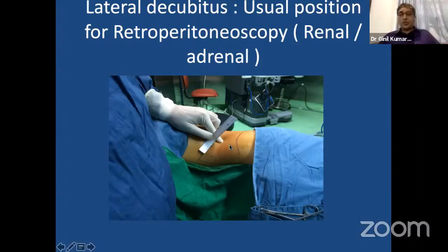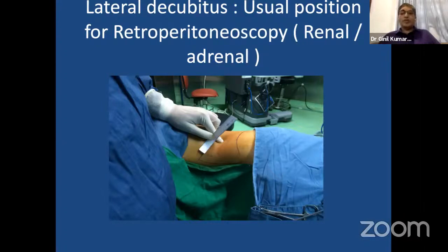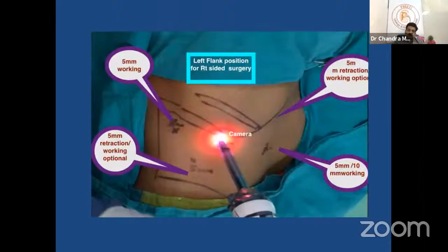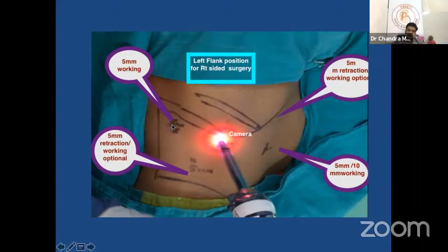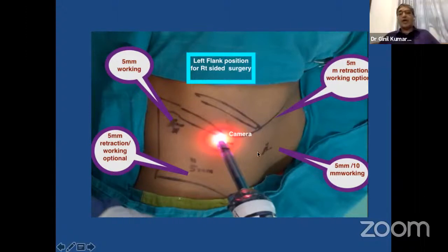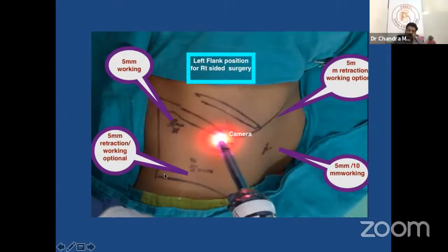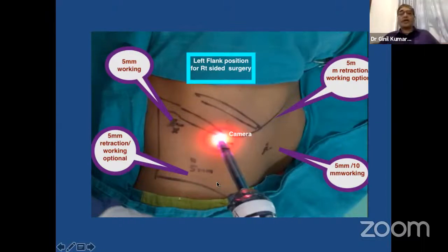The patient is kept in lateral decubitus, which is the commonest position. It is not that lateral decubitus is the only position — we can also approach the adrenal from the posterior aspect — but I am first describing the lateral decubitus position for adrenalectomy. This is the port placement as discussed: a 5mm working port in the posterior renal angle, anteriorly lateral to rectus abdominis, and inferiorly either posterior or anterior to the anterior superior iliac spine according to your convenience.